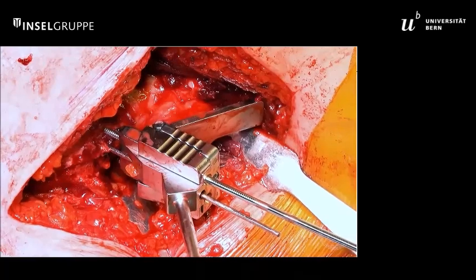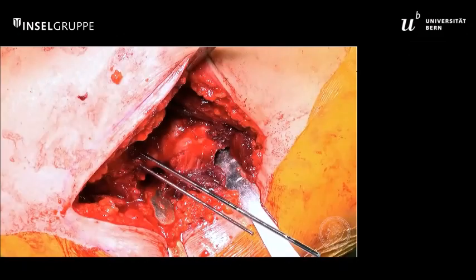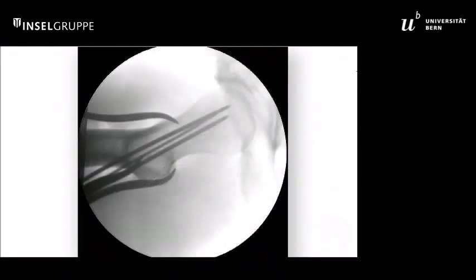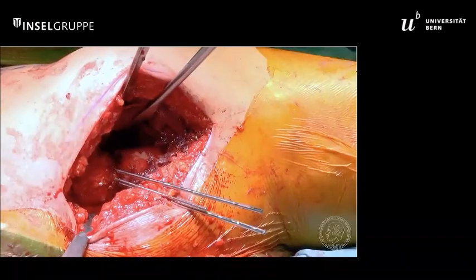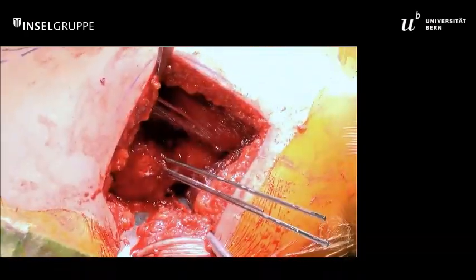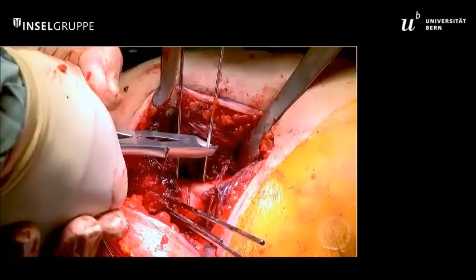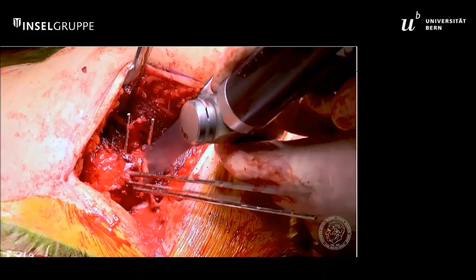This is the first 2.8-millimeter K-wire. We check again radiographically in two planes. After control of appropriate position, the second 2.8-millimeter K-wire is inserted. Then we check the appropriate level of the osteotomy under fluoroscopy and make sure that bone is exposed subperiosteally at the level of the osteotomy. We briefly mark the osteotomy level with the oscillating saw. Before the osteotomy is completed, two K-wires are placed parallel above and below the osteotomy level in order to control rotation of fragments — we use 2.0 K-wires. Then the osteotomy is completed and completeness assured.